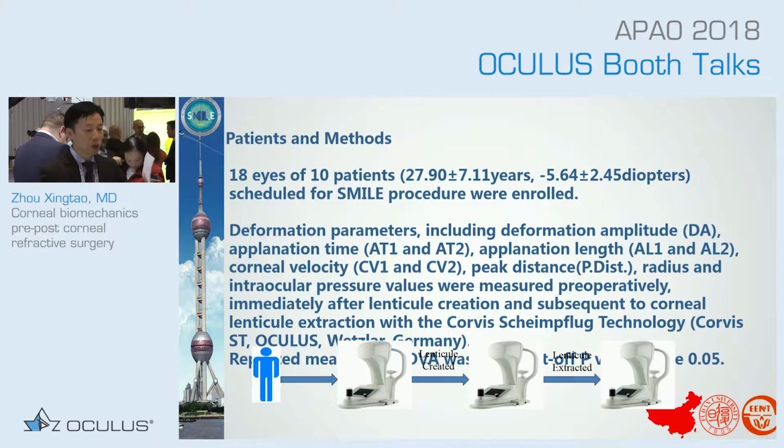with a mean age of 27.9 years and minus 5.64 diopters, scheduled for SMILE.